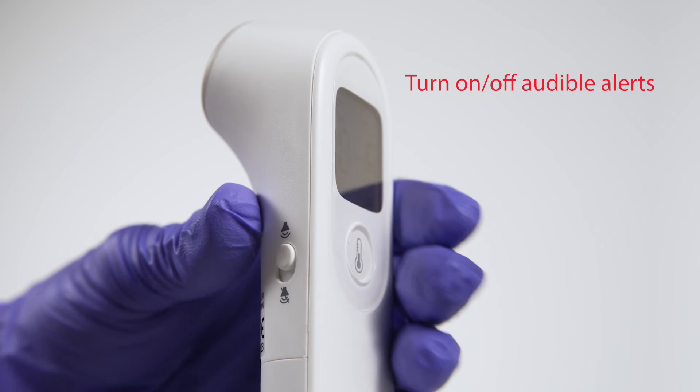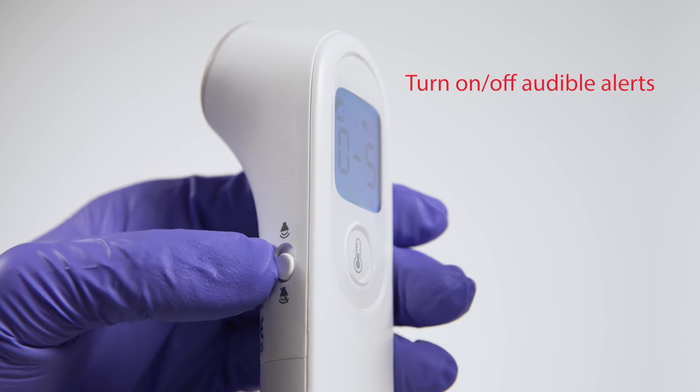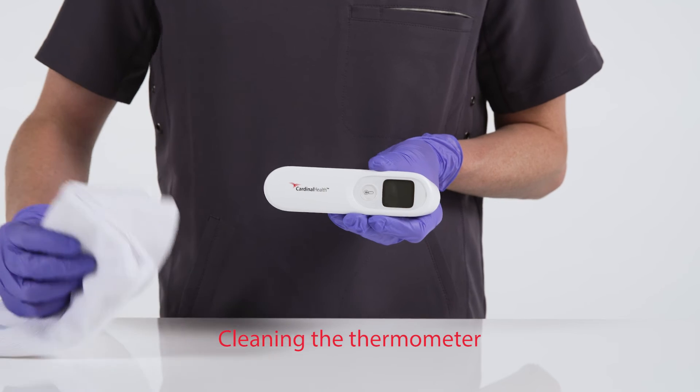Users who prefer not to have audible alerts can also adjust the sound setting by sliding the switch on the side of the device.